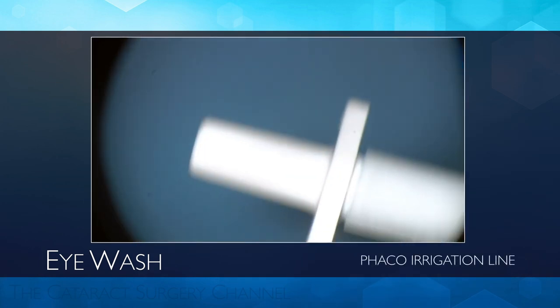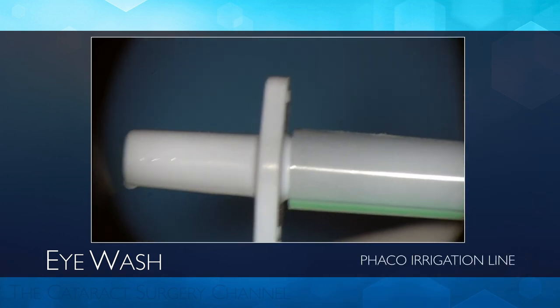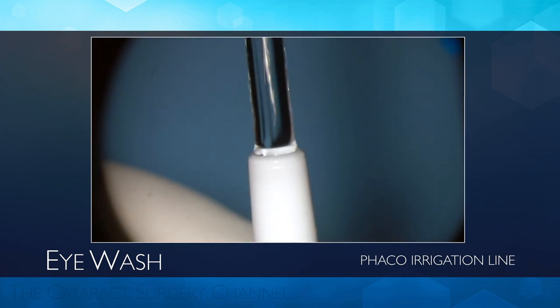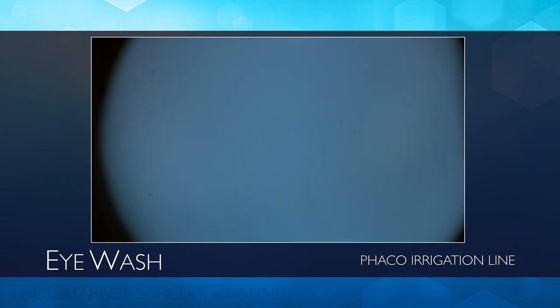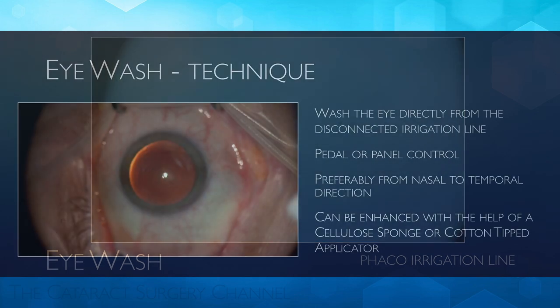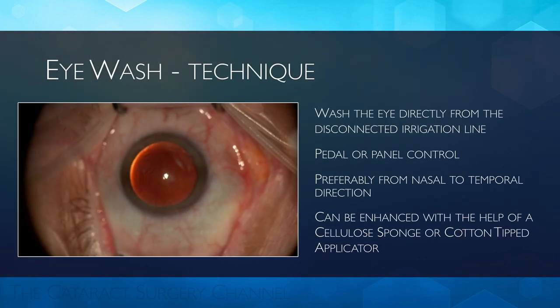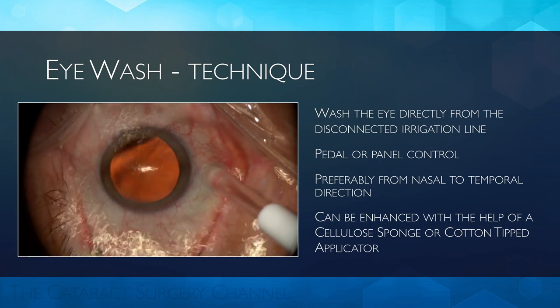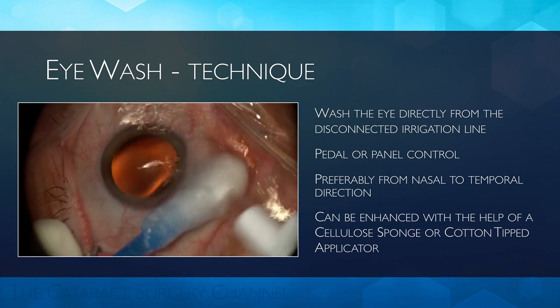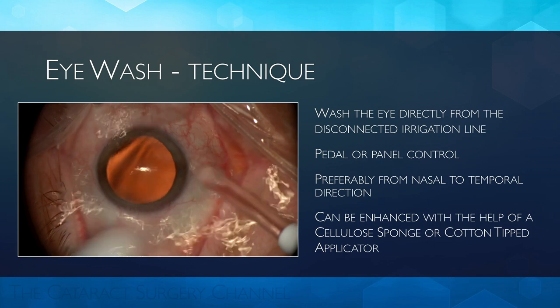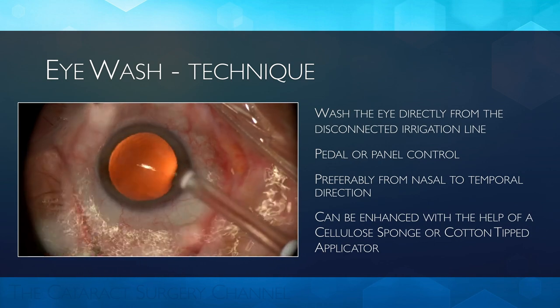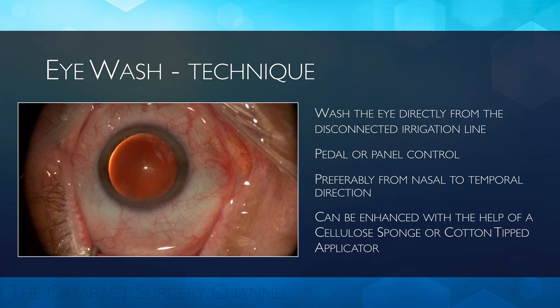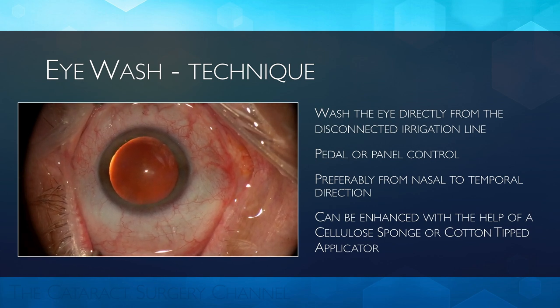Eye wash is a term I coined to refer to the act of washing the eye with the phaco irrigation line. Wash the eye using the disconnected irrigation line under pedal or panel control. Going from nasal to temporal direction makes it more effective, guiding the debris towards the bag. A cell sponge or Q-tip can be used to enhance the cleaning action.